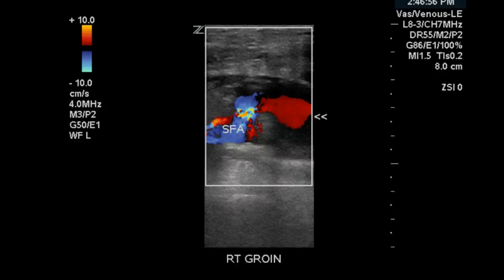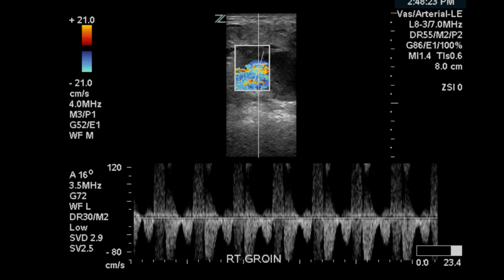Here we have another example of a pseudoaneurysm. However, in this case, we have a patent PSA. Immediately you see the blood flow coming from the SFA and bleeding into the encapsulated pocket and the surrounding tissue. In this image, we sample the neck of the PSA and you can see the to-fro flow pattern, which simply represents flow into and out of the sac.